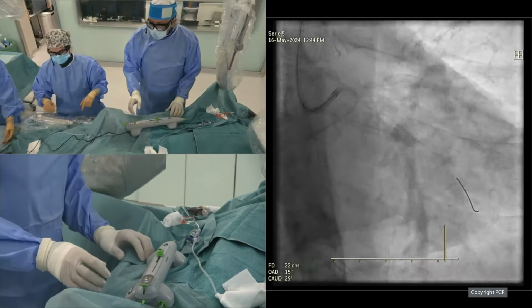Okay, Nieves is putting a bit of tension, and I'm crossing. Okay, stop now. So I'm going to store this. So you've seen the whole maneuver. Put it in glide assist. Nieves is applying a bit of tension. The crown points downwards, and then it crosses.